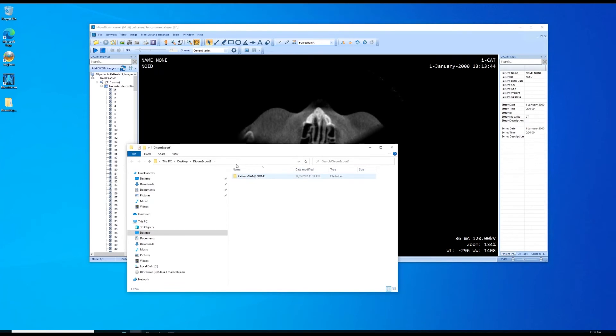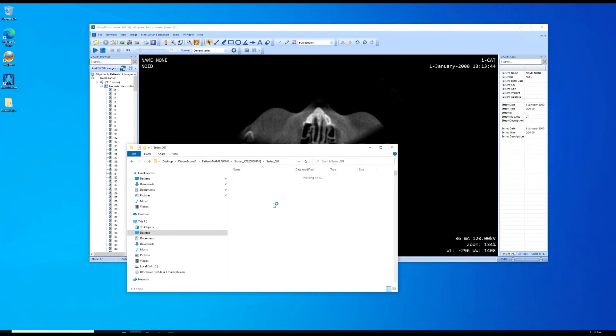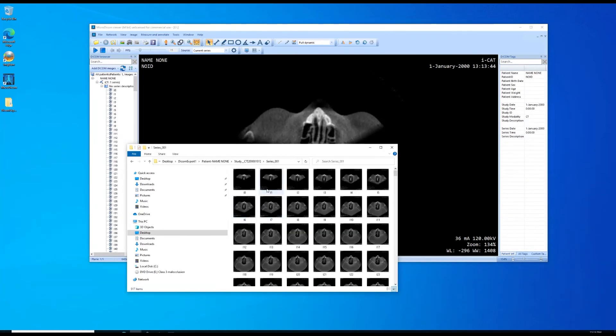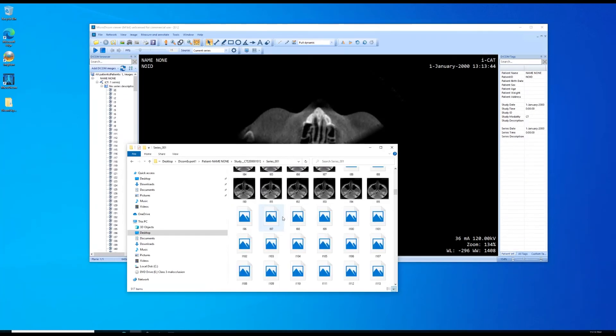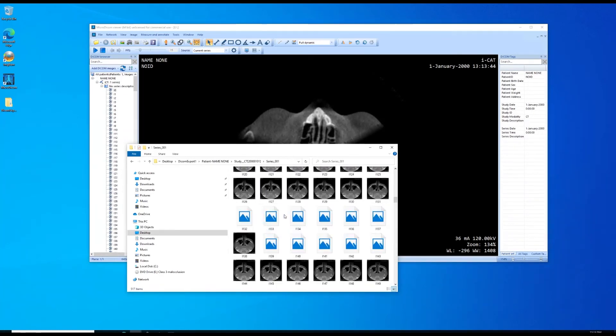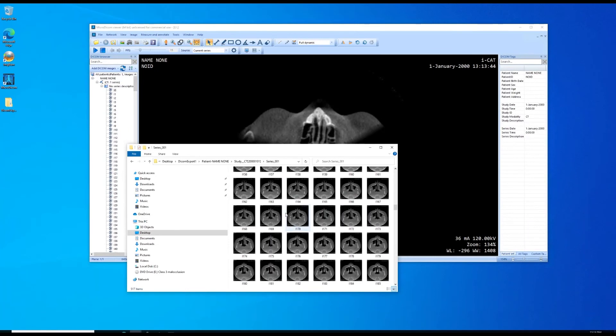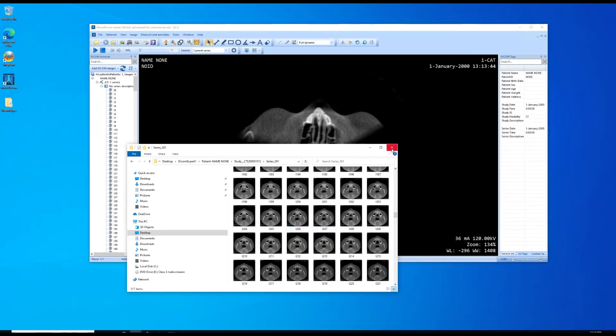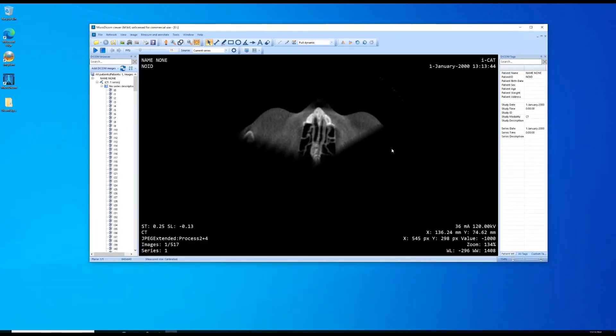It exports them and shows us the folder that it exported them to. You double click in there. We can take a look at our images that we exported and there they are. So we're done with that.